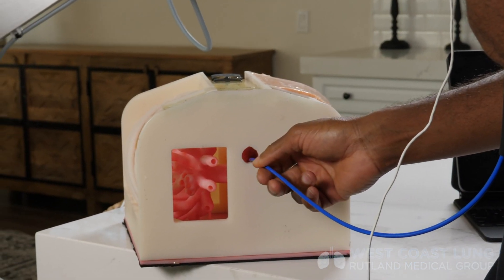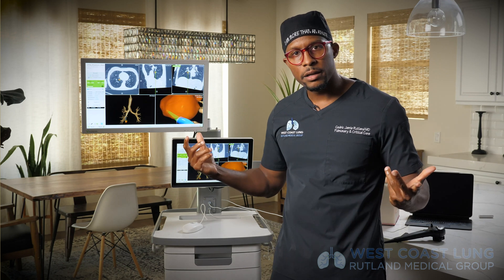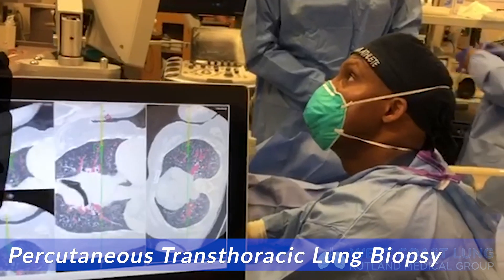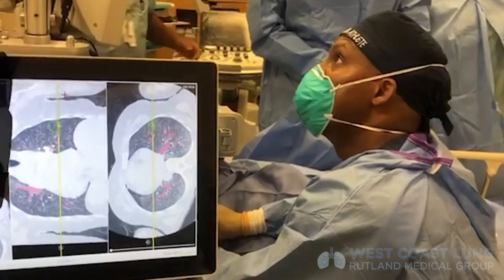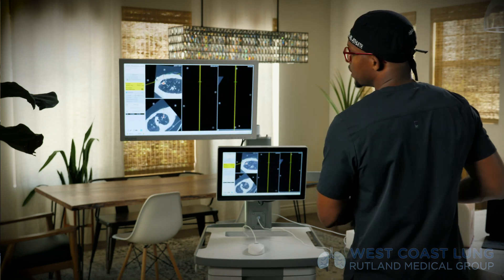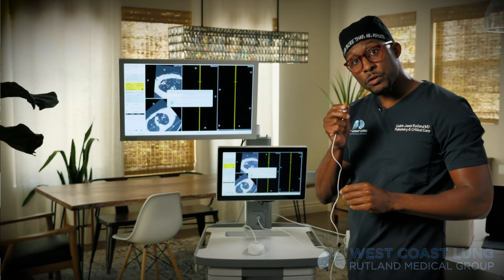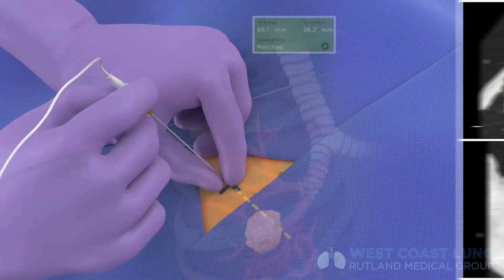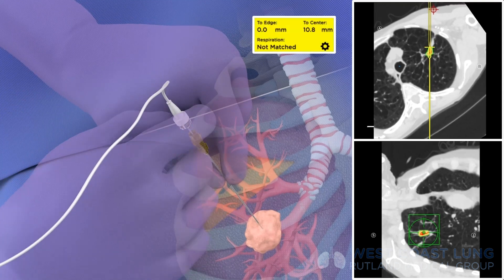But what if there's no airway that guides you to the lesion? What if you can't get there from the inside? With other technologies you might have no other option, but with this technology you do: it's called a percutaneous trans-thoracic biopsy. In other words, I'm going to stick a needle through the skin over a rib directly into the lesion. On this CAT scan you can see a left upper lobe lung lesion, and on the needle there's a tip tracking instrument right at the tip. The vascular bundle runs inferior to the rib, so you want to go over the superior aspect of the rib. Once you get into the lung, you're able to guide yourself to the lesion.